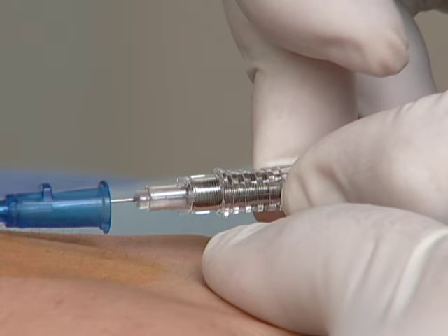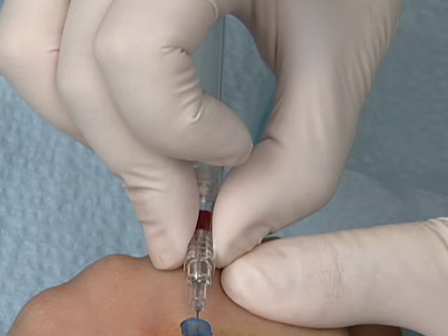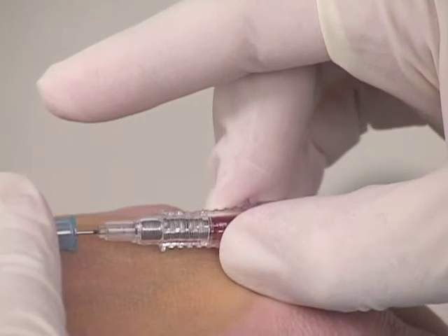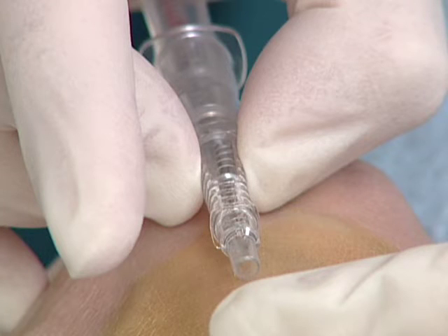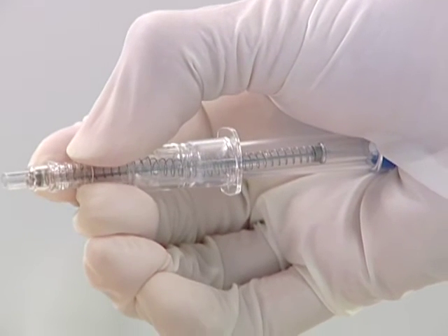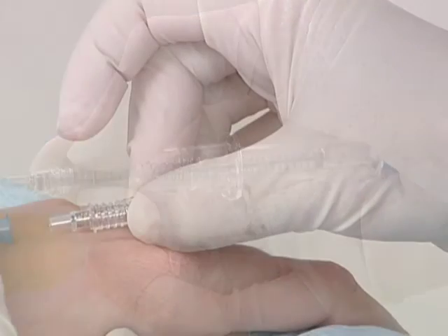The Vanishpoint IV catheter is composed of an introducer needle and housing, which includes a retraction mechanism within the housing and finger grips for pulling back on the housing to activate the retraction. The finger grips and flashback chamber are clear to allow for flashback visualization. The end of the housing is color-coded to indicate the catheter gauge, and the catheter hub is also color-coded according to international standards. The push-off tab facilitates one-handed hub advancement and indicates bevel orientation.